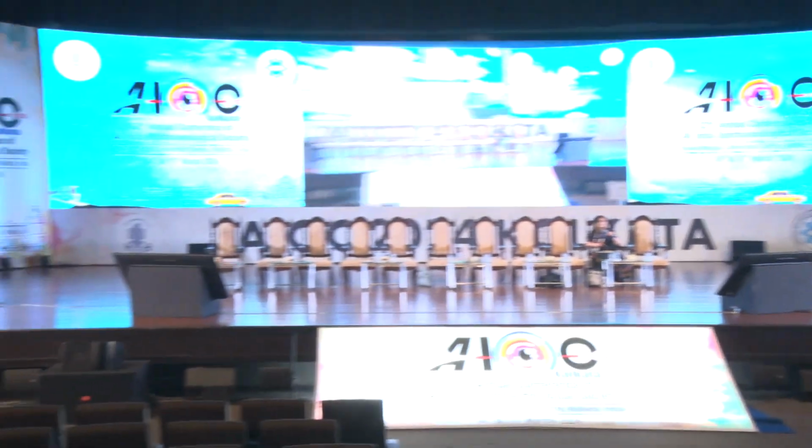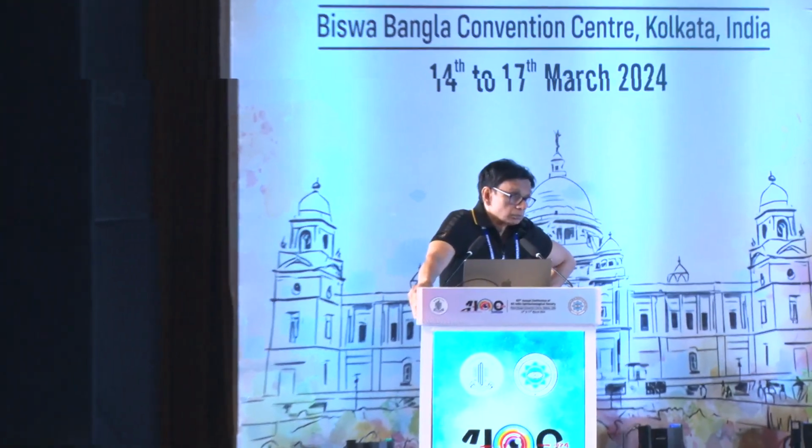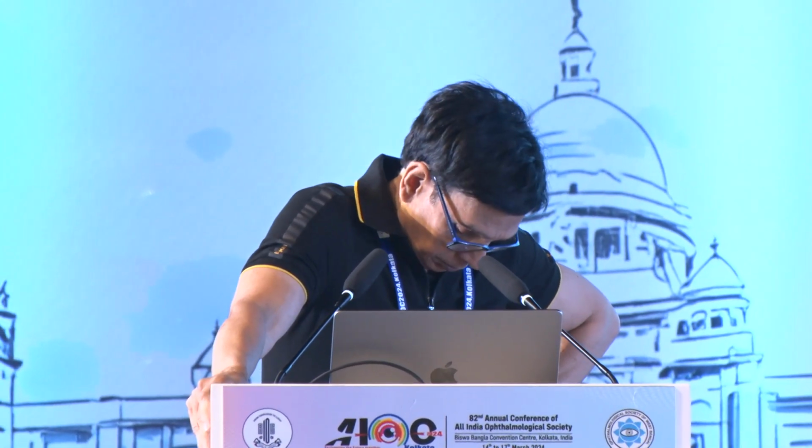So I think the moral of the story was that, whenever you have a posterior rupture, if you have the anterior capsular rhexis margin intact, it helps you a lot to handle this, at least for the IOL implantation. Second most important thing is learning how to do a vitrectomy. That is very important, which I will be trying to showcase during my presentation.